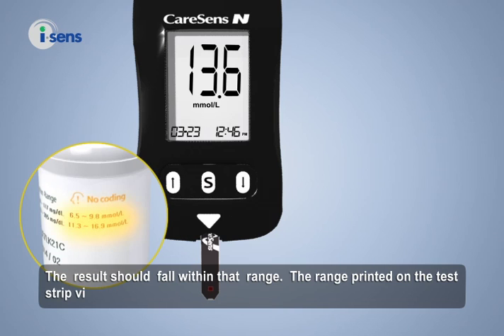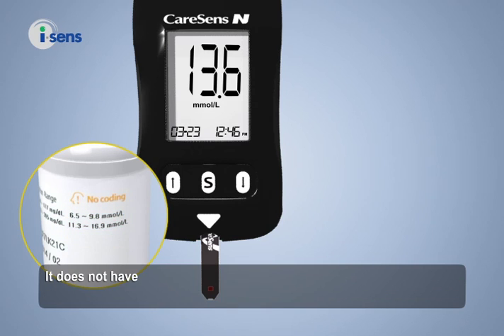The range printed on the test strip vial is for the CareSense control solution only. It does not have any connection to your blood glucose level.